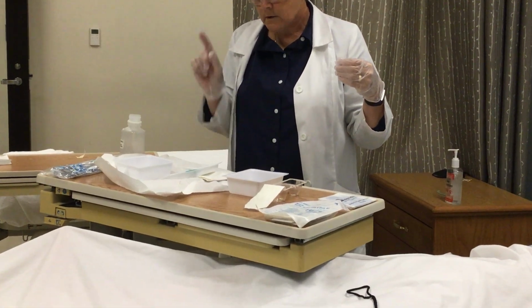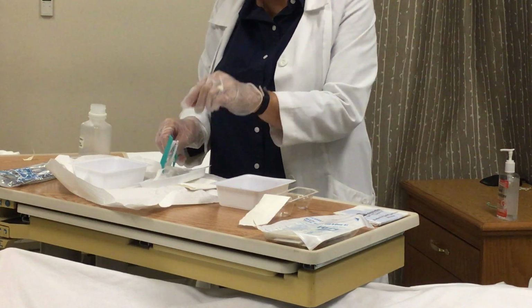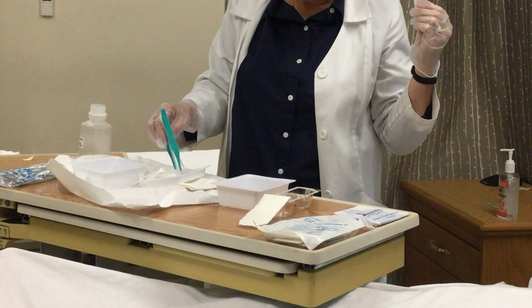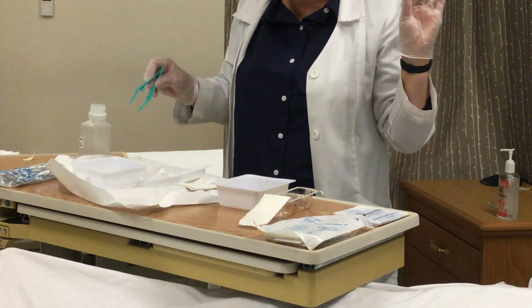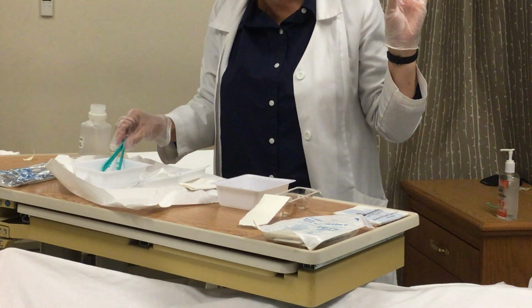So this particular commercial kit comes with a pair of forceps. I have to do this kind of one-handed because this hand is the hand I used for removing the inner.